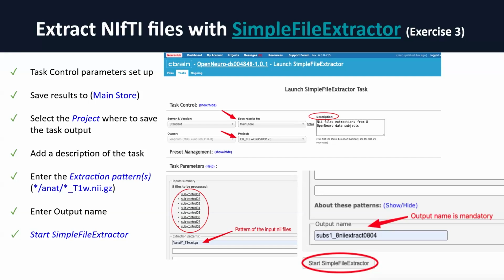You'll see that particularly when you get to actually running CIVET, because there won't be enough slots running at the same time. But in practice, these quick tasks, conversions and extractions, you can run directly on the internal server. Running CIVET and FreeSurfer, you absolutely need to run on the supercomputer system, because that will take like 5 to 7 hours, depending on the subject and how many subjects you're running.